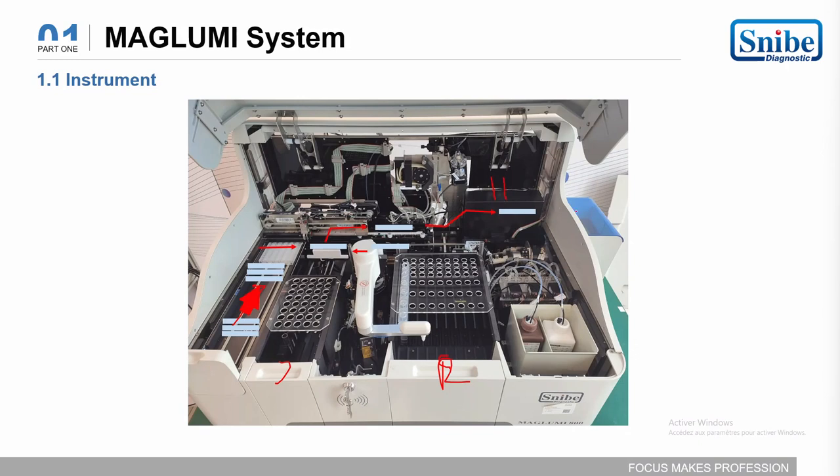Then the cuvette will be discarded into the cuvette dustbin. This is the one-step assay procedure.